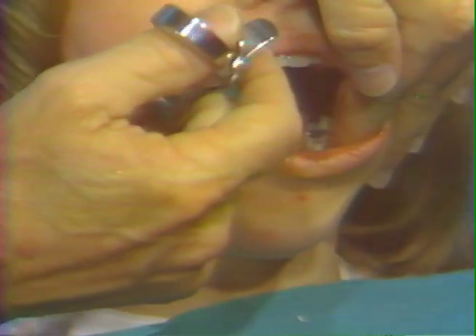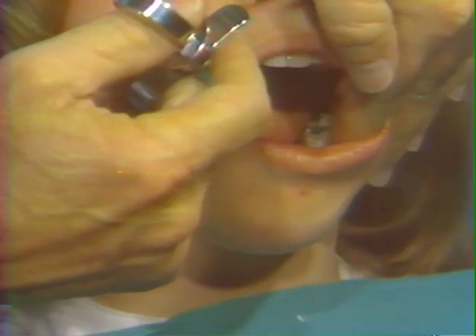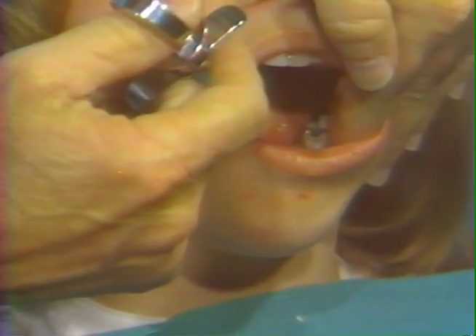For the left anterior portion of the lingual nerve, the index finger can be used for retraction, open real wide, placed once again into the area of the first bicuspid teeth through the floor of the mouth mucosa, solution deposited and withdrawn.